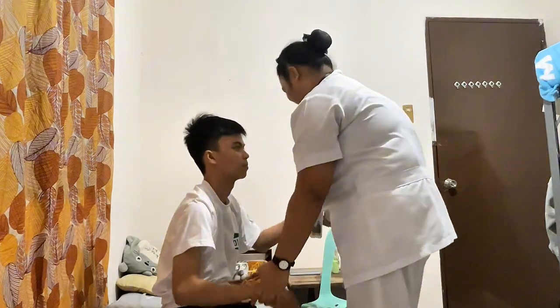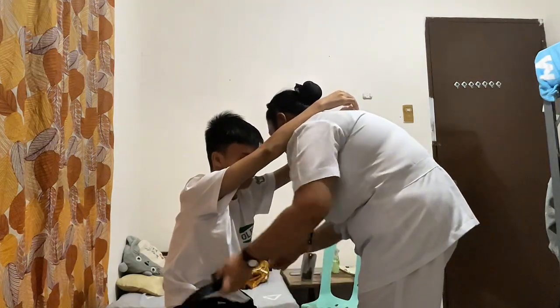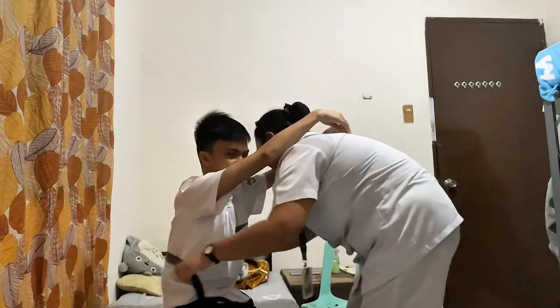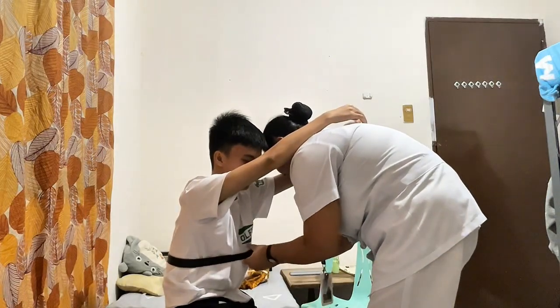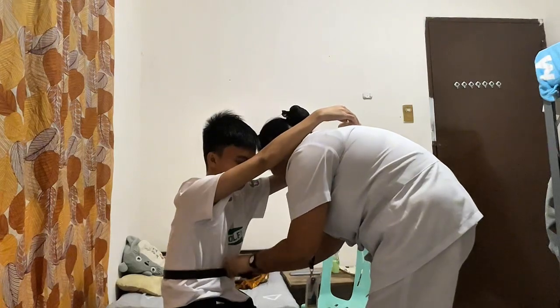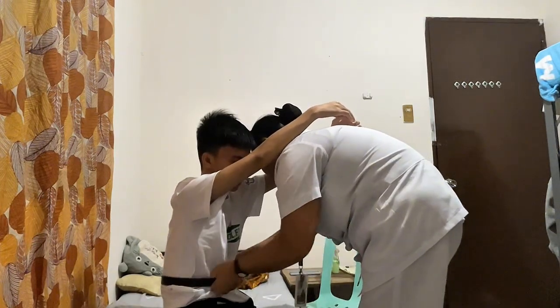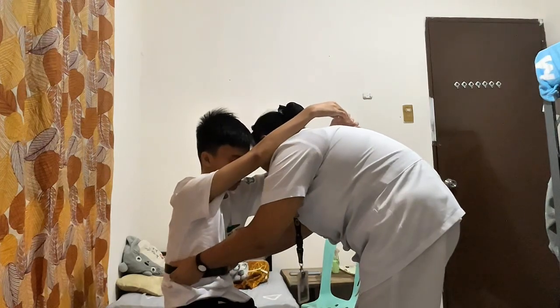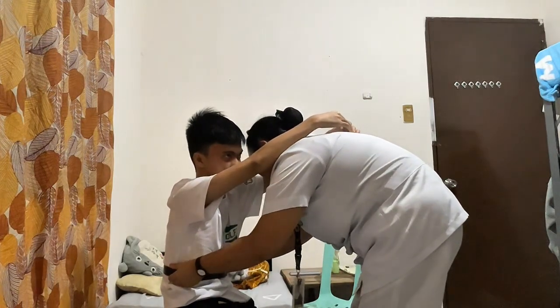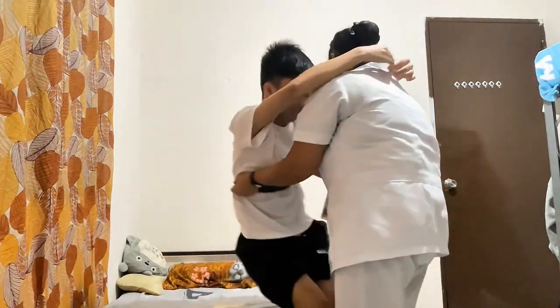Okay. I will now put the transfer belt on the patient. And I will now carefully lift the patient to the chair.